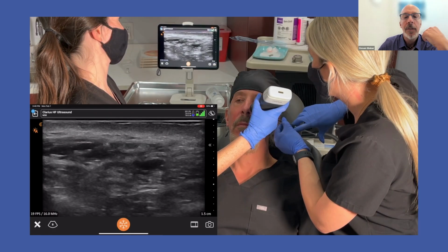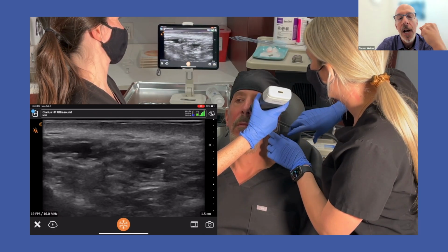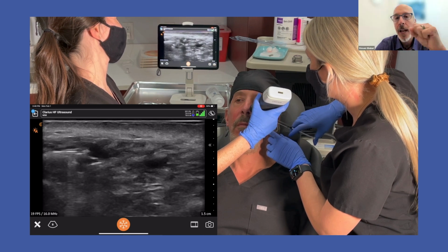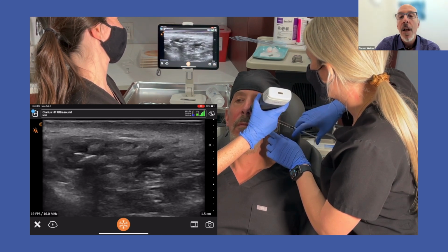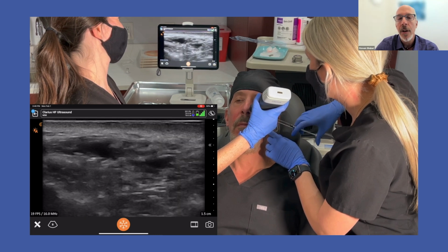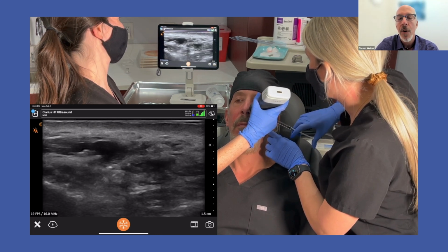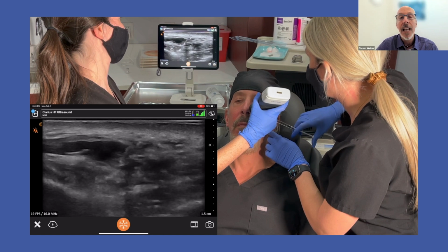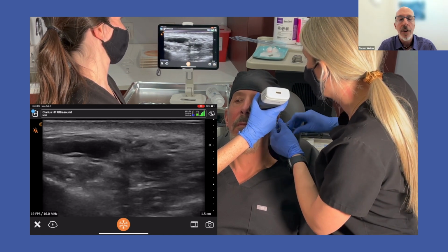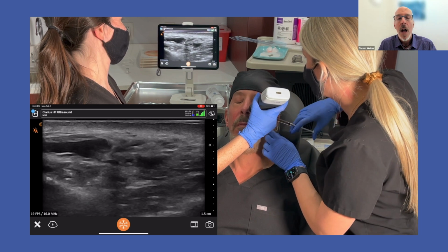So let's go on to dissolving of my tear trough area, my PA on the right, my nurse on the left. Now, this is one way to do it, and I recommend doing this for the early users of ultrasound, because it gets complicated when you have to look at the screen, inject, and hold the ultrasound at the same time.